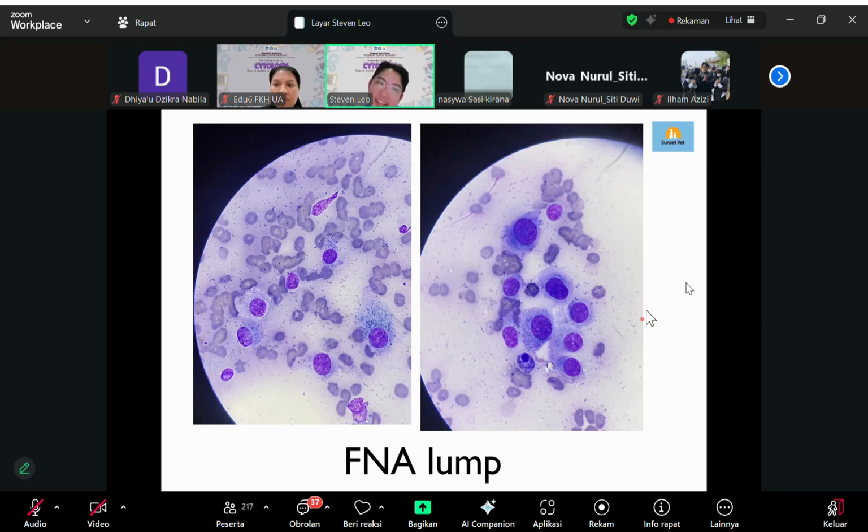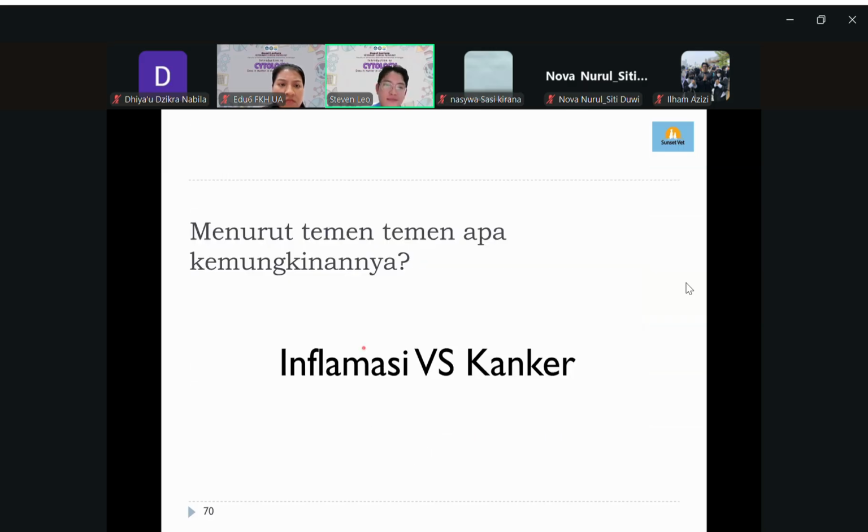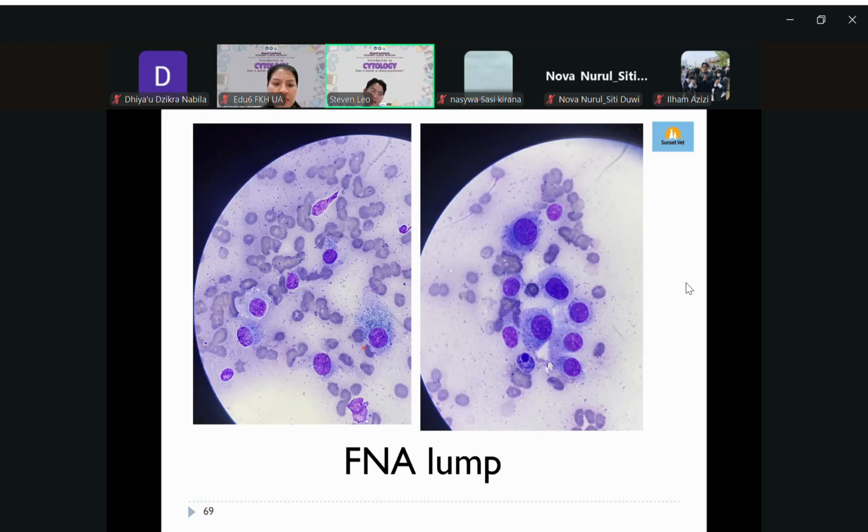Okay, so it's cancer. What kind of cancer? With the obvious one, like this one, yeah. This is typically granules. With the black granules, it's melanoma. Yeah, this is typical of melanoma.